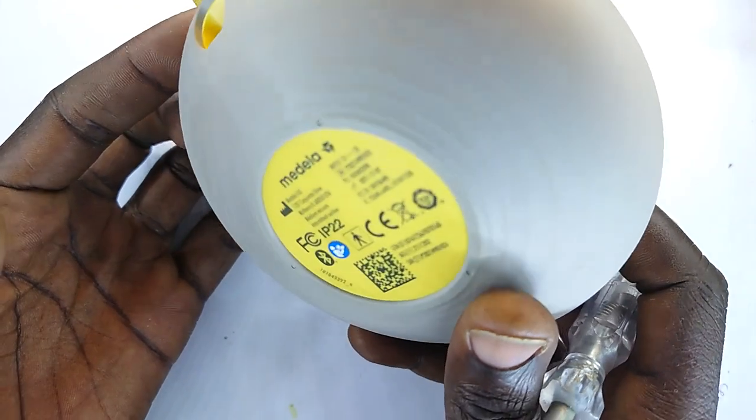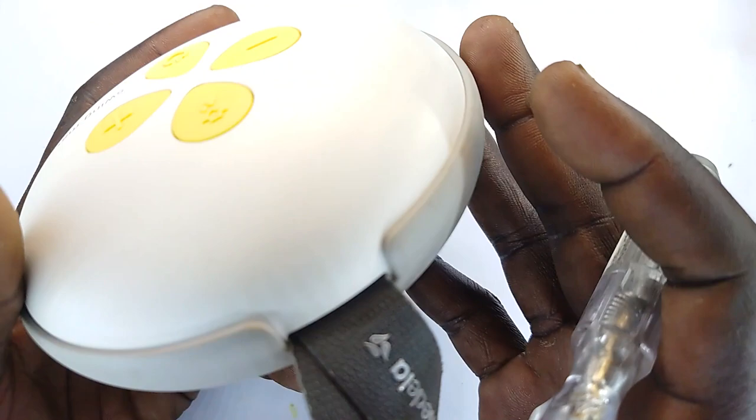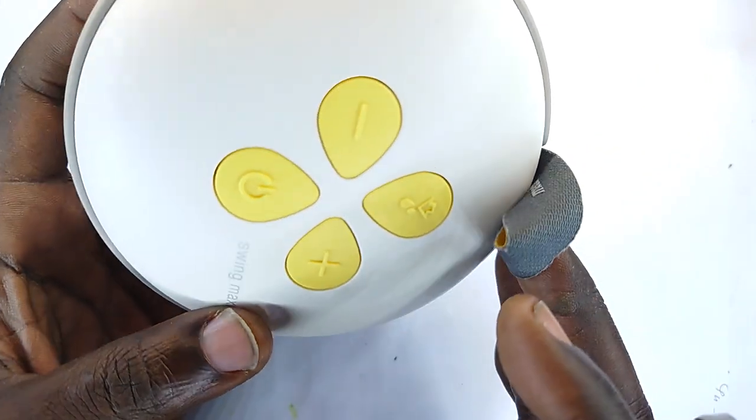Some are manually powered, but this is the automatic one — it's electronically powered. This is the rechargeable type; you can see the charging portion.